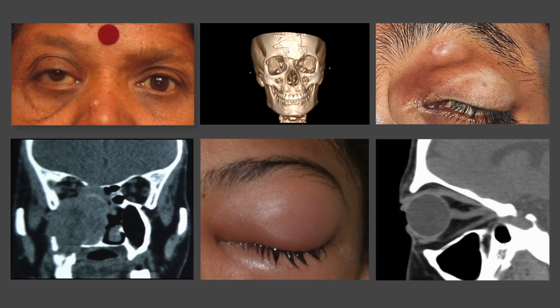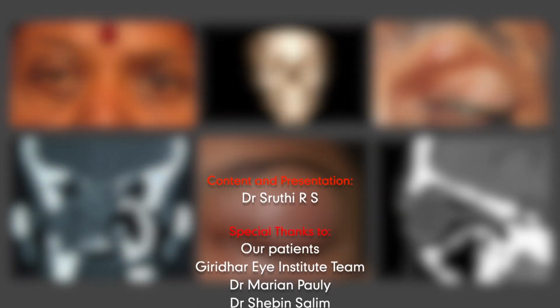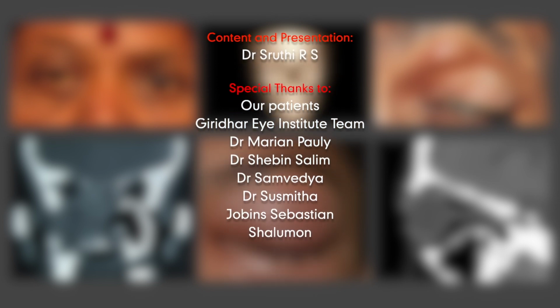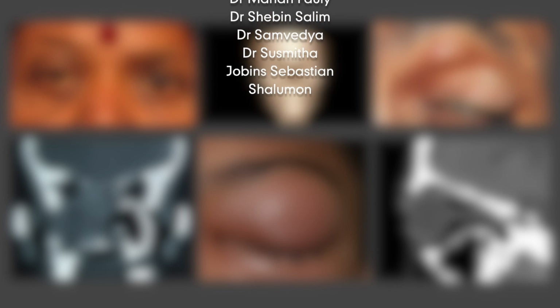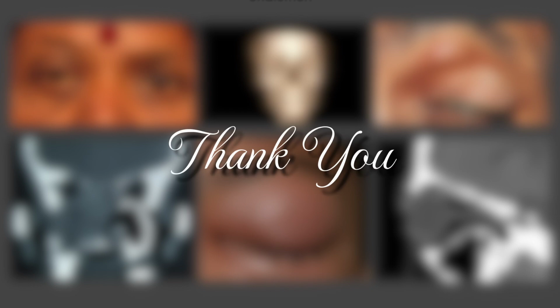To conclude, CT scan is an important utility in the diagnosis and management of most orbital and several ocular disorders. It is imperative for us ophthalmologists to be able to systematically and objectively interpret a CT scan and provide maximum information that can be useful in the accurate clinical diagnosis and optimum patient management.